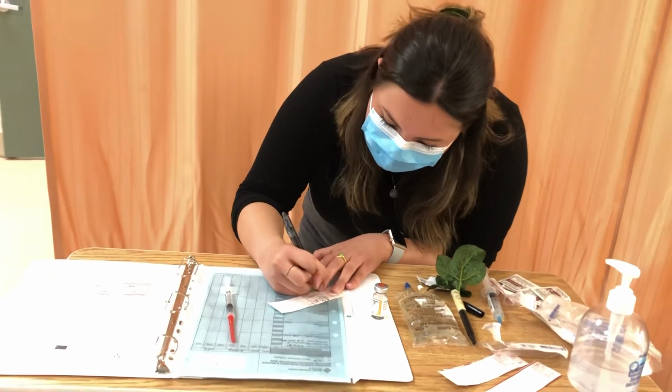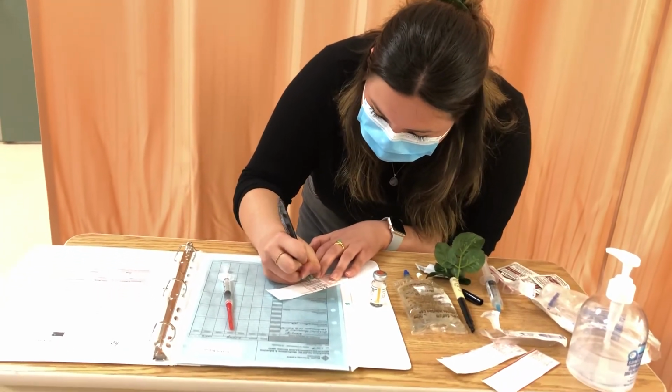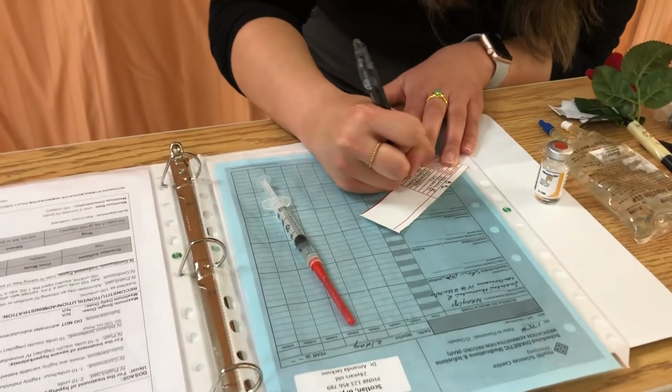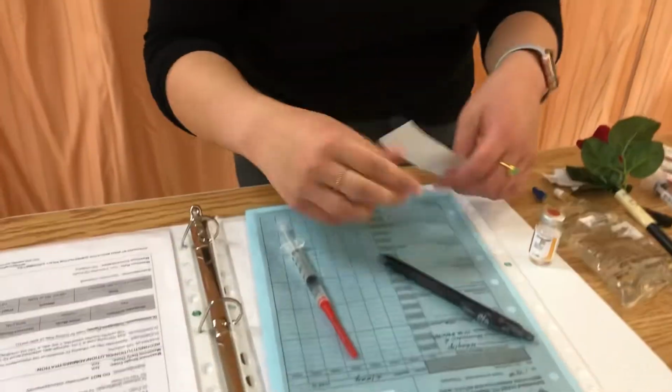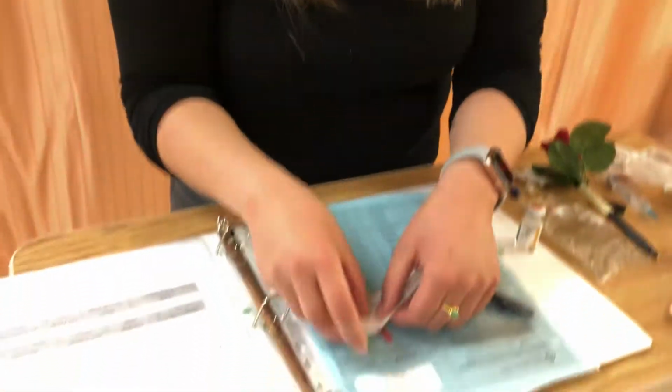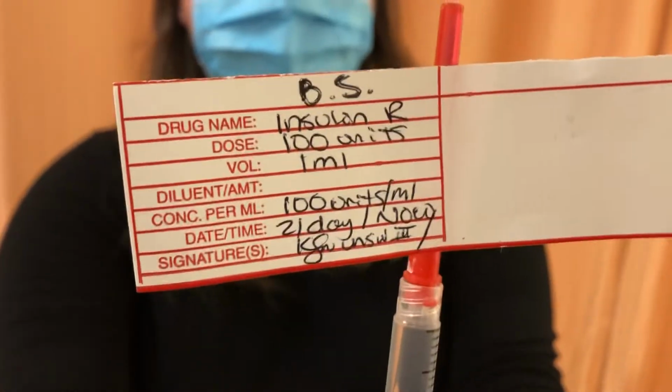I'll wash my hands first. Before I get started, I'll swab my medication vials. For the purposes of this demo, I'll just be using one swab for each. But in a real clinical situation, I'll be using one swab for each vial, and I would have swabbed it for 30 seconds and waited 15 to dry.